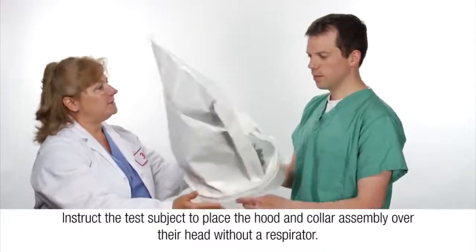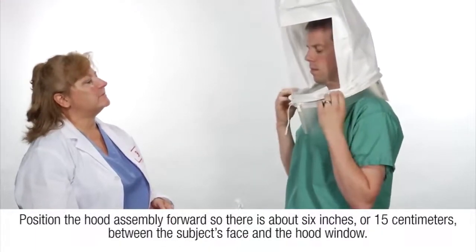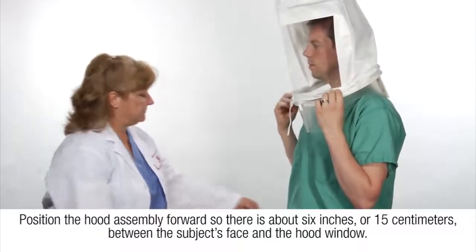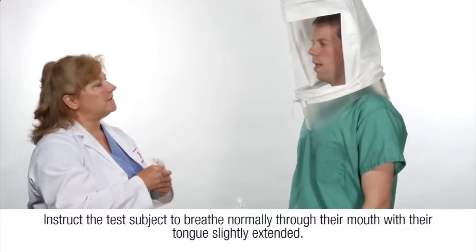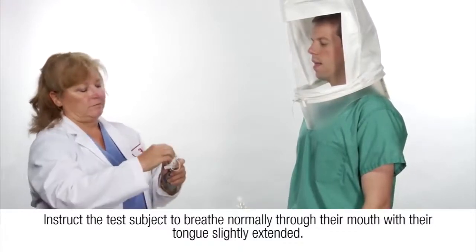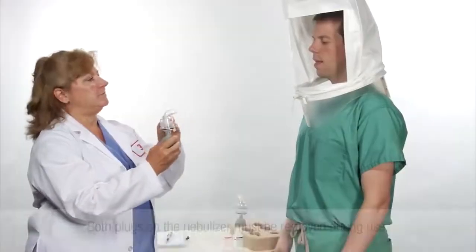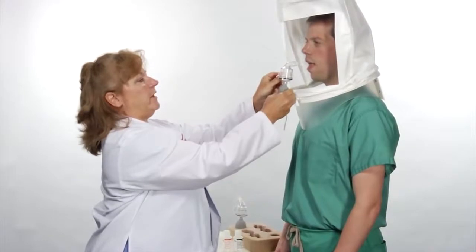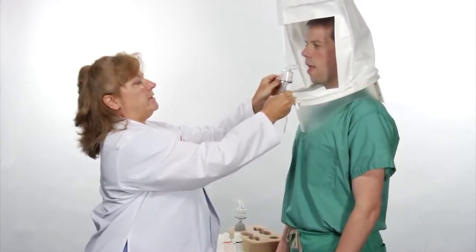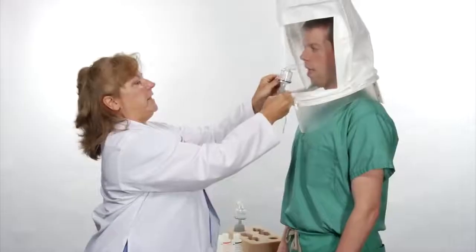To conduct the sensitivity test, instruct the test subject to place the hood and collar assembly over their head without a respirator. Position the hood assembly forward so there is about six inches or 15 centimeters between the subject's face and the hood window. Instruct the test subject to breathe normally through their mouth with their tongue slightly extended. Both plugs on the nebulizer must be removed during use. The nebulizer must be held in an upright position to ensure aerosol generation. Using the first nebulizer with the sensitivity solution, inject the aerosol into the hood through the aperture in the hood window. Squeeze ten times, always fully collapsing the nebulizer bulb on each squeeze. Allow the bulb to extend fully between squeezes.